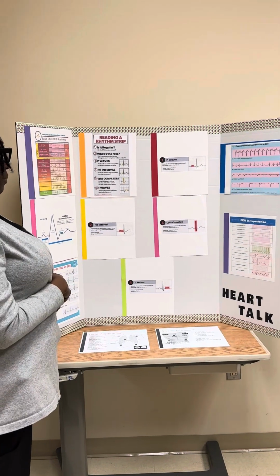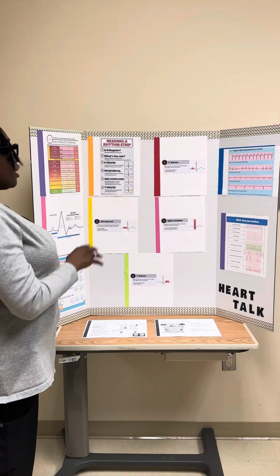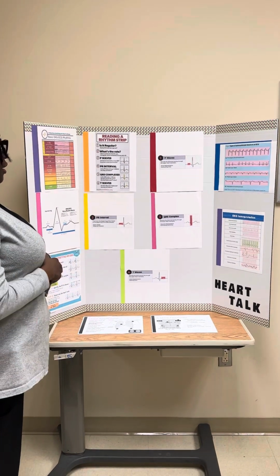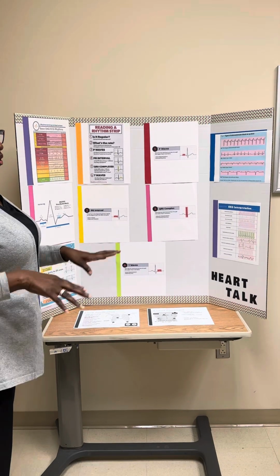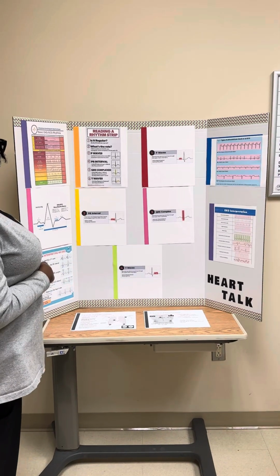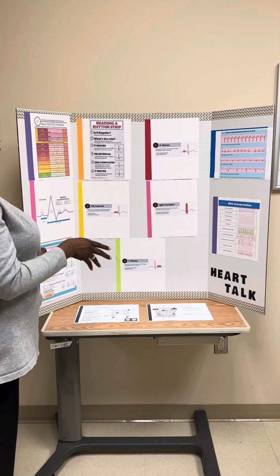The takeaway is going to be to always assess your patient. We're not assessing that monitor. All right. So no matter what it's saying, sometimes we'll get an irregular rhythm. You go in and the monitor's not even on the patient. It's on a gown. It's on underwear or whatever. So know your patients.